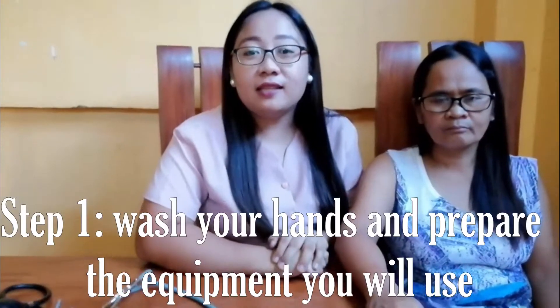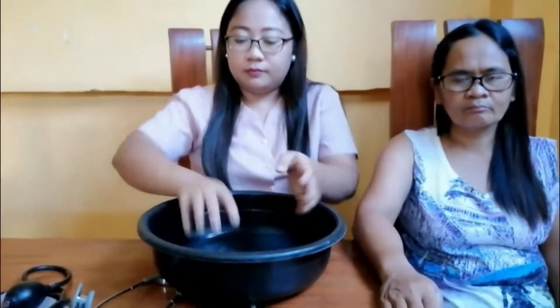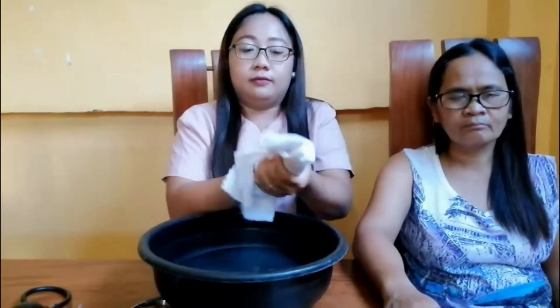Now I will measure my mom's blood pressure. Step one: wash your hands and prepare the equipment you will use. You can use water and then dry your hands, or you can use alcohol to sanitize your hands.